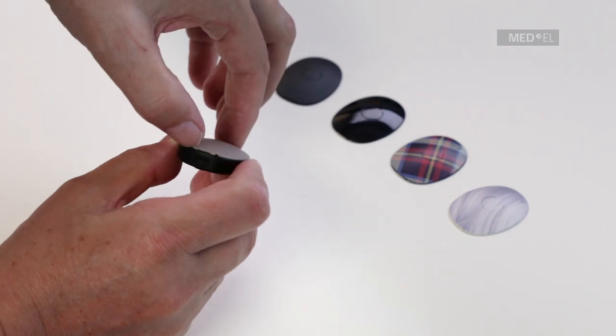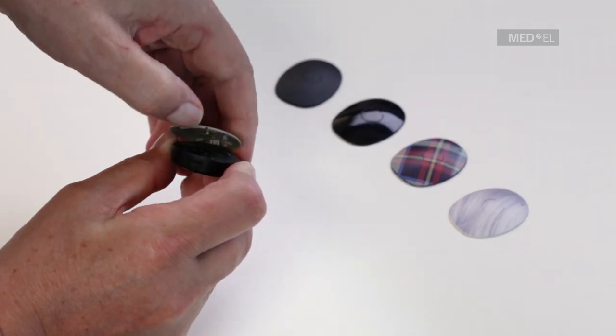Insert your fingernail into the groove between the processor and the cover. Gently lift up the cover.